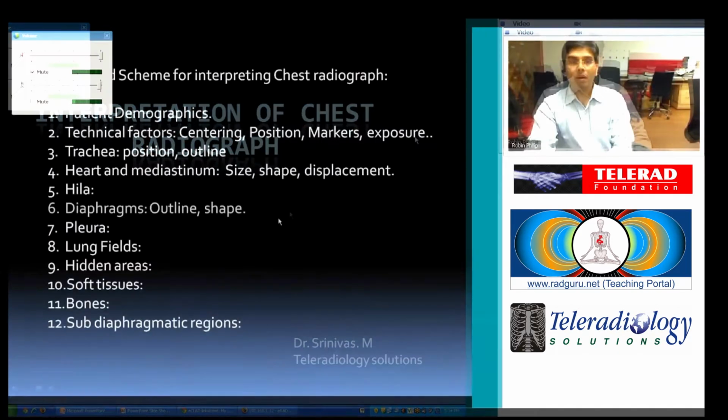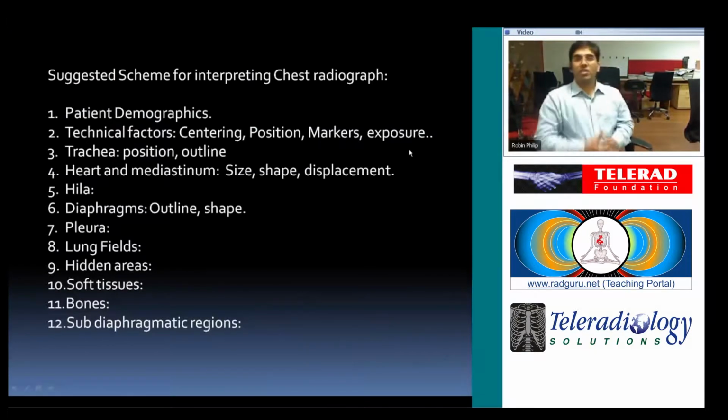Let's go ahead. Chest radiograph is one of the frequently ordered radiographic examinations in children as well as adults. Hence, accurate interpretation is very important for administering appropriate therapy. So for that, there is a systematic way of interpreting the chest X-ray. It goes like this. This is a suggested scheme.